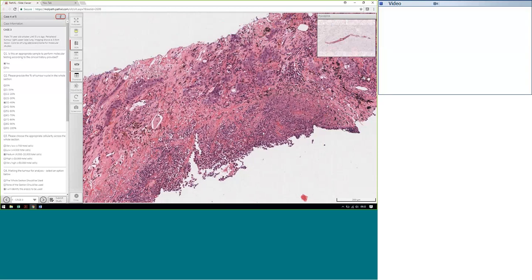But again, I think it's up to the participants with their downstream application how important they consider this to be. Yeah, precisely. It depends on how much DNA you need for what you're doing with it, doesn't it, really? Yes, so, and how, yeah.